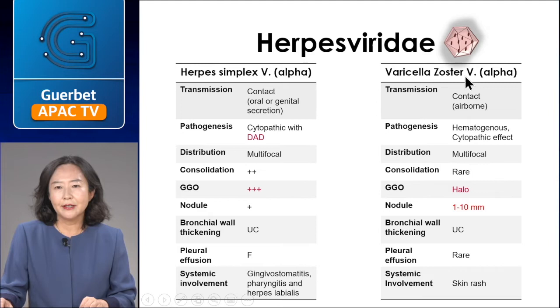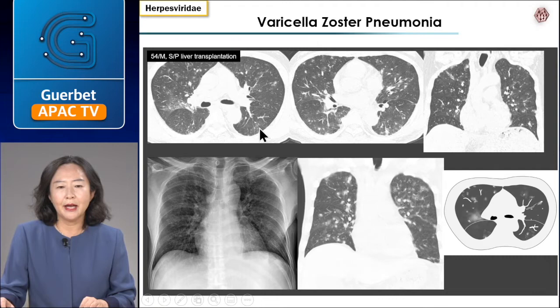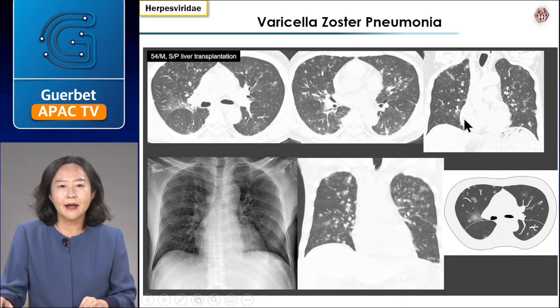Herpesviridae also includes varicella zoster pneumonia. Varicella zoster virus spreads hematogenously. CT scan shows multifocal small nodules with surrounding halo. This is a 54-year-old man presenting with fever and cough who underwent liver transplantation three years ago. Varicella zoster pneumonia presents as multifocal 1–10 mm well- or ill-defined small nodules with surrounding halo or ground-glass opacities. This pneumonia occurs two to three days after developing skin eruption, especially in immune-compromised hosts.